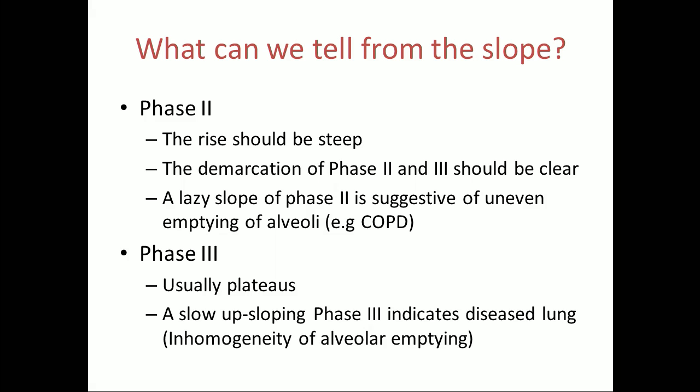So what one would expect in normal breathing lungs is a very square-shaped capnogram. If you've got homogeneous lungs where there's synchronous emptying of your alveoli, you would see a short phase 1 and then a very sharp phase 2, in a very small volume difference. So the delta volume is very small. You see a sharp increase in concentration of carbon dioxide followed by a very rapid plateauing.